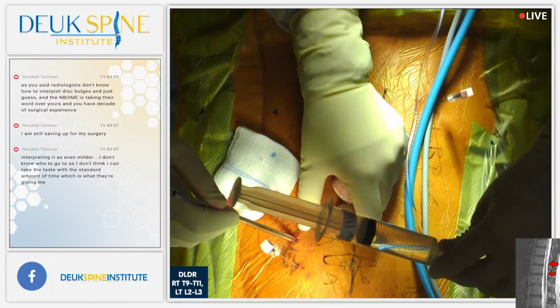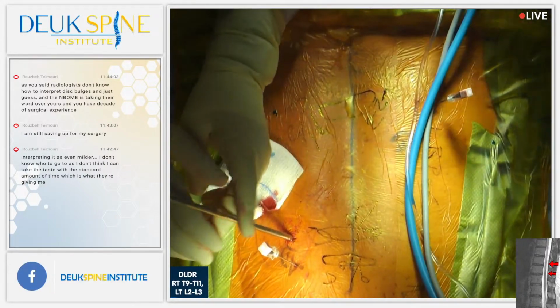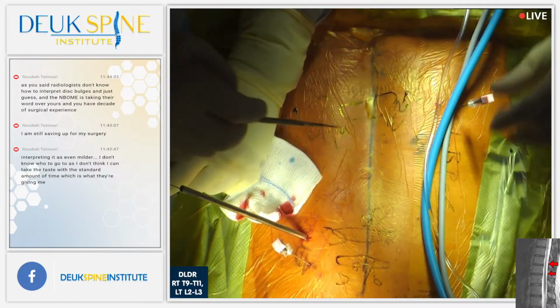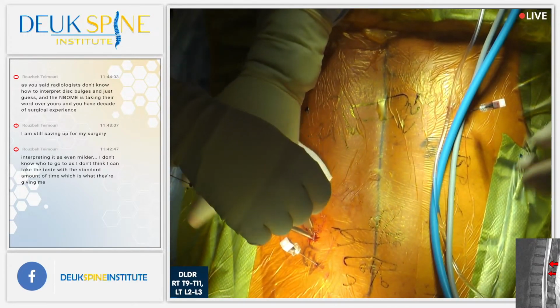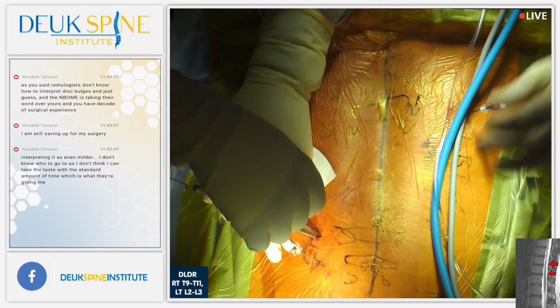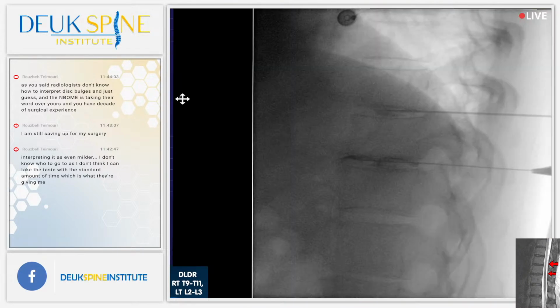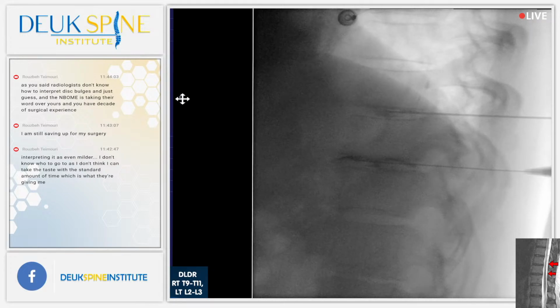Okay. It's a little tight here on the skin. Let me have that 11 blade. I'm going to open up the skin because I think that the skin incision on the surface is 7mm, but down inside it's not. There we go. That should make it better. Let's have some num-num. So right now I'm bouncing on his fascia. You guys see this? Henry? Henry, move your arm, please. Henry, you see the bouncing?